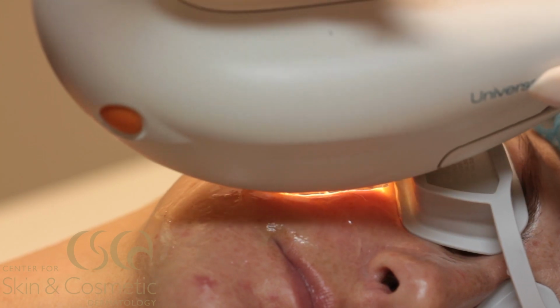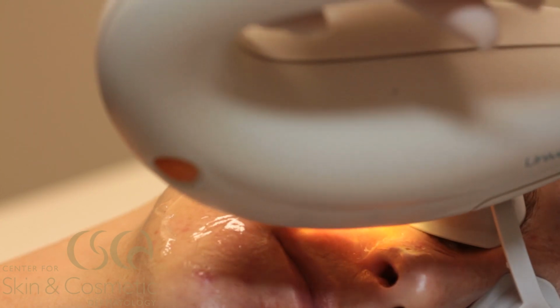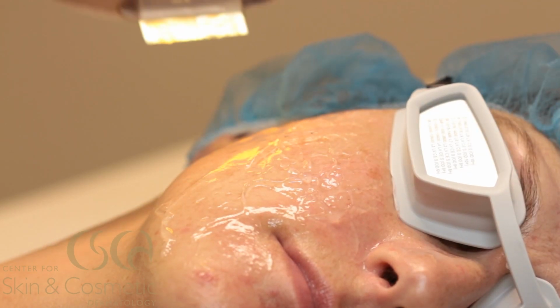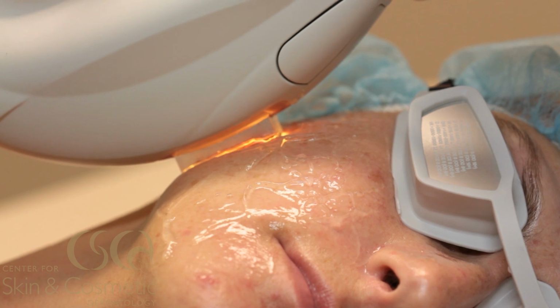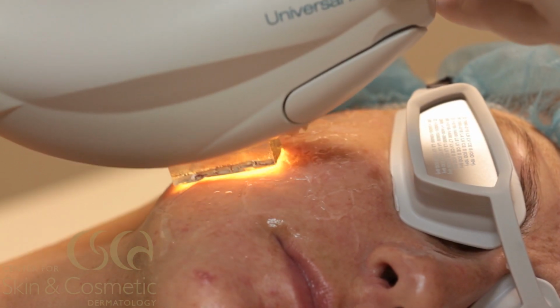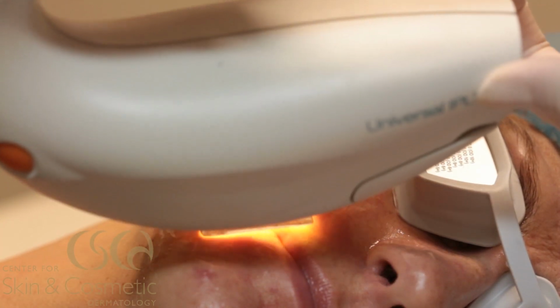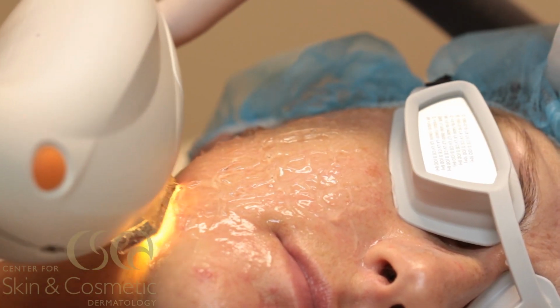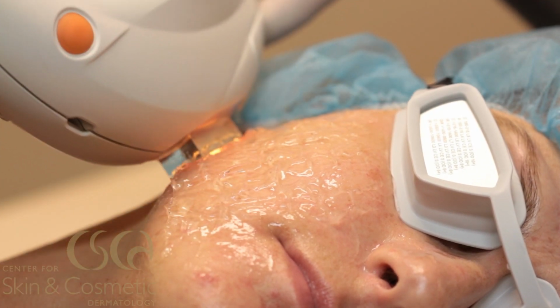Intense pulse light, or IPL, is used to treat anything red and brown, superficial red and browns, meaning it's perfect for rosacea, for little broken capillaries, little small veins on the face. Also very good for treating age spots, sun damage, freckles, any of that thing. When we're treating the red conditions, the rosacea, for example, or a broken capillary, when we shoot the IPL device, we choose a wavelength that's appropriate based on the patient's skin type and where we think that vessel lies within the tissue. It's a really great machine because we have the ability to choose based on depth, which doesn't limit us for what we can and cannot treat on the skin.